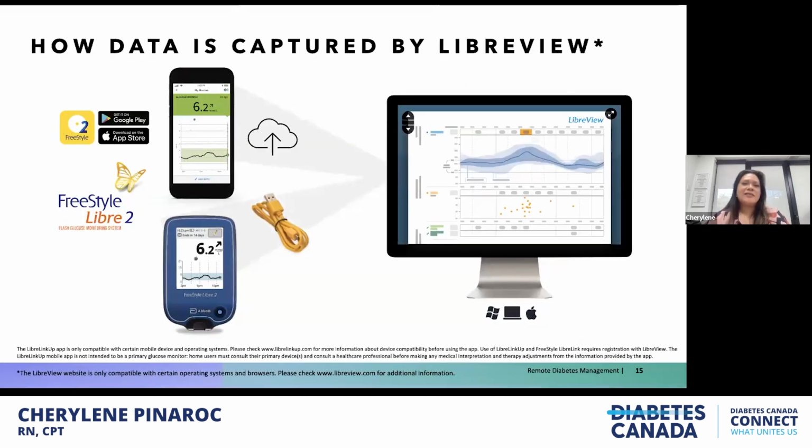So there's basic ways that your data is captured. One of the ways that we look at is actually using LibreView. When you create your account on your phone, currently with the application, LibreView is automatically created, okay? And if you're using the readers, you would have to go into the website, libreview.com, and actually create an account, and then you can pair yourselves with a healthcare professional.